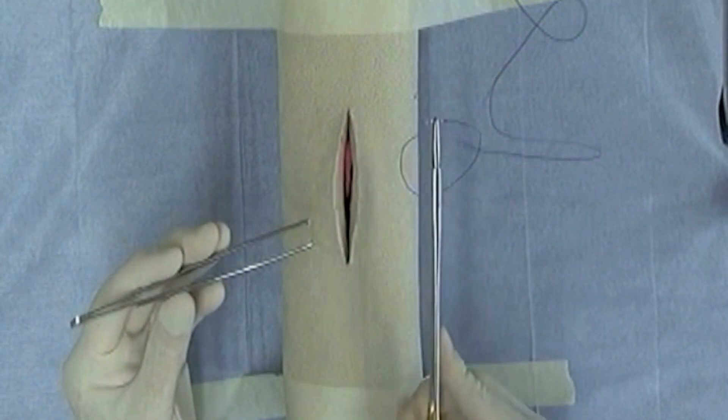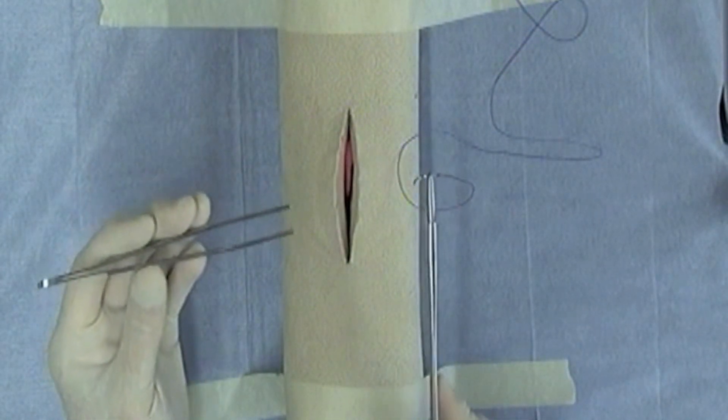Generally, if you're right-handed, you're going to have the needle holders in your right hand and your thumb forceps in your left hand.